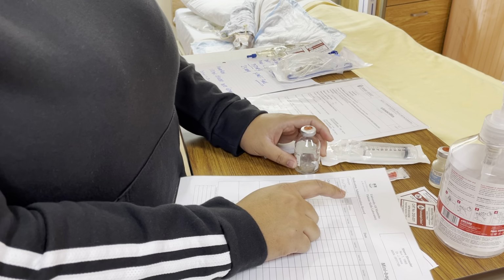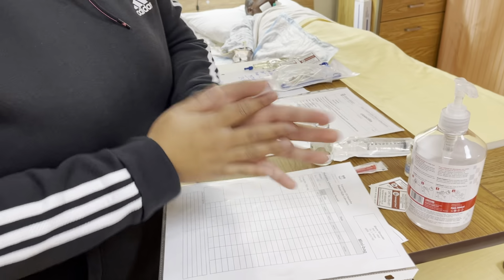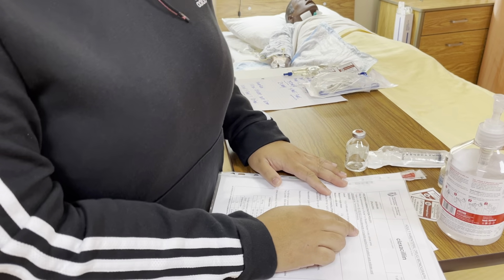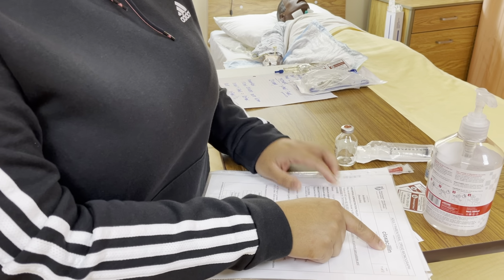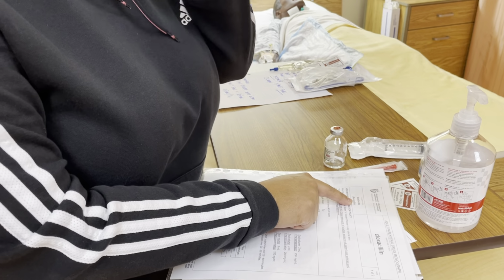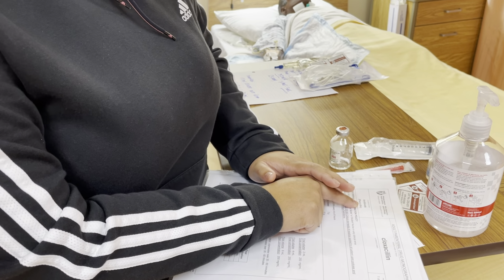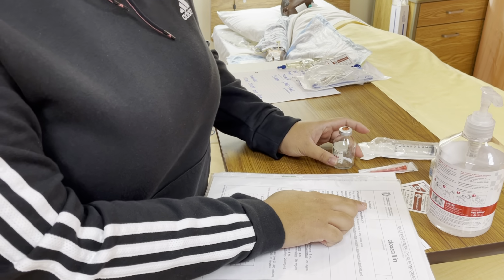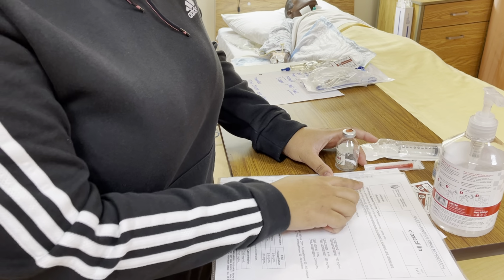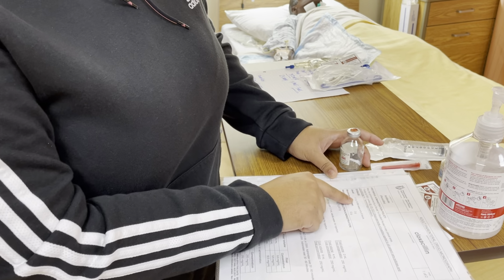So the next thing I'll do is another hand hygiene and then look at my PDM. The things that I'm looking for is the name of the drug, Cloxacillin, and this is an antibiotic. My patient was diagnosed with sepsis on her foot. So that's what the medication is for, antibiotic, which is appropriate for an infection. It says here may be administered by a student nurse. And then we're looking at the dosage.